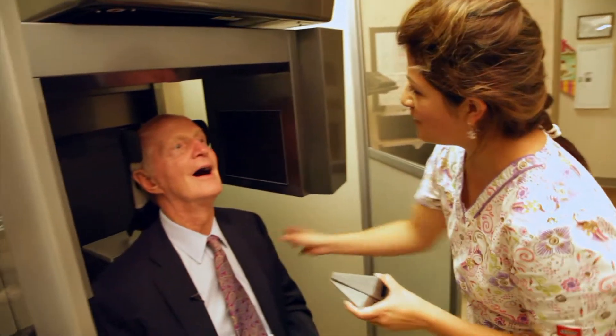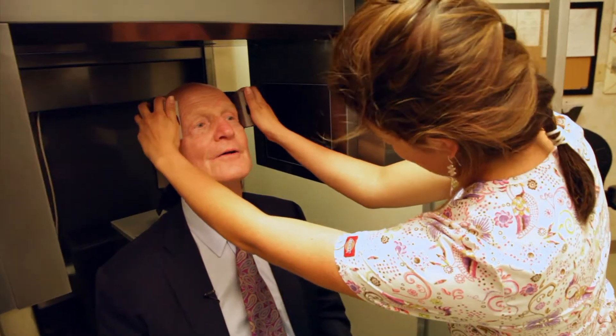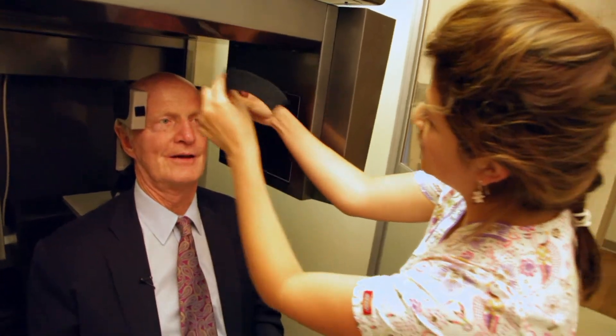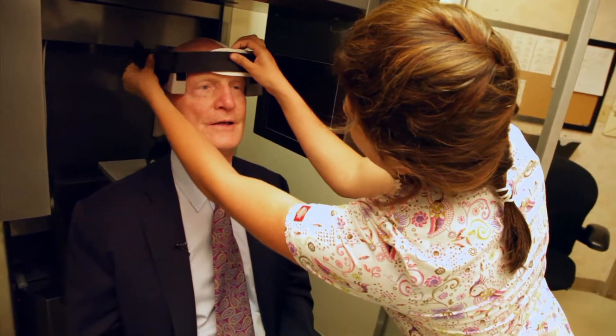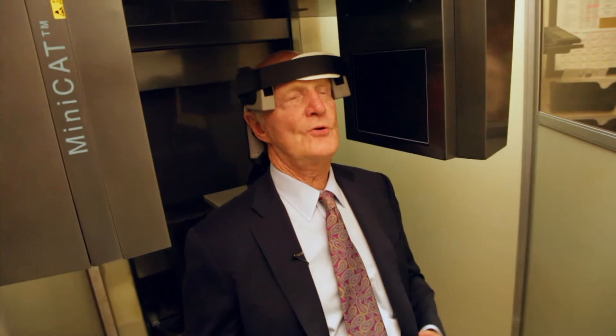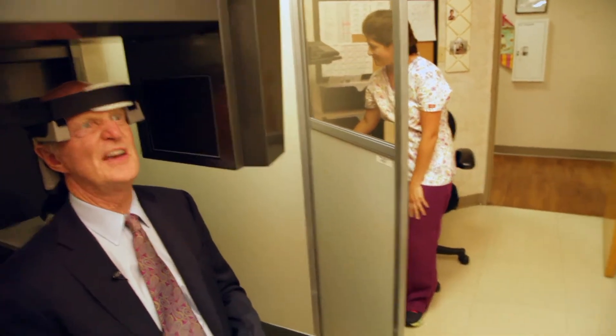Let's see what it's like. I've asked Aida to come and situate me. Lean your head all the way back. I'm going to place two sponges on the side of your head and bring your chin down for me. I'm going to place one more strap across your forehead to reduce the motion — so that keeps you stable. It's going to take only ten seconds, and I'm supposed to be very still.